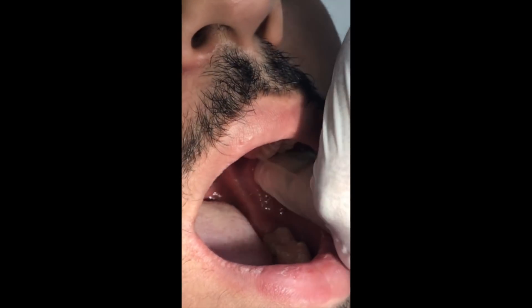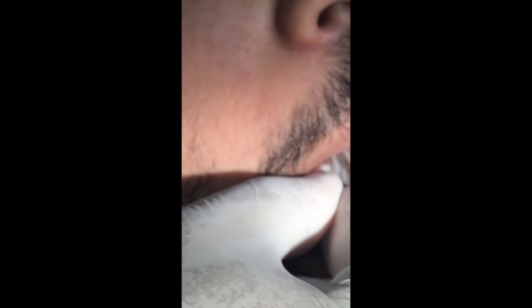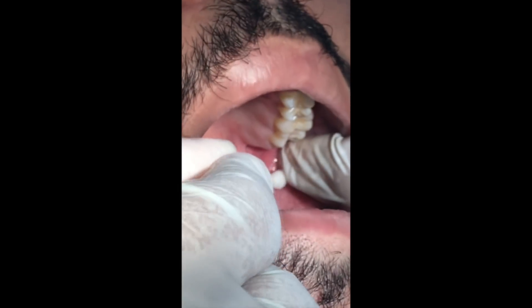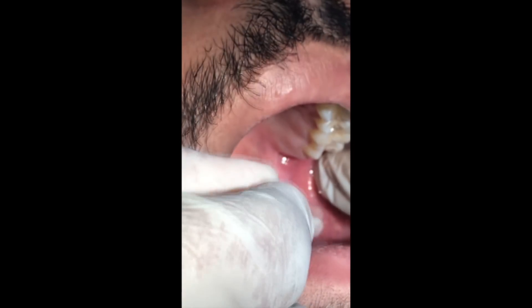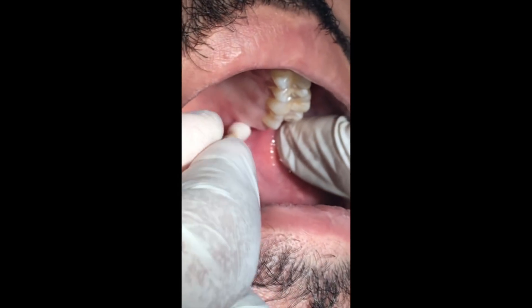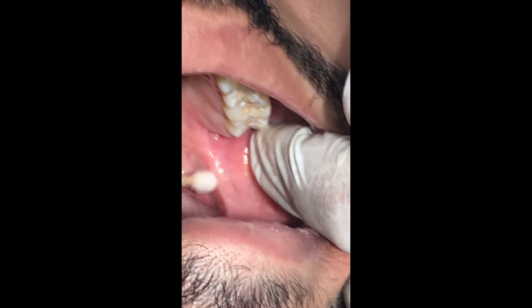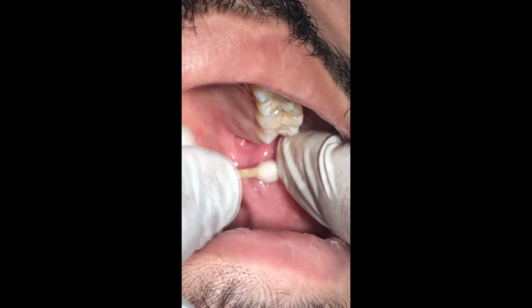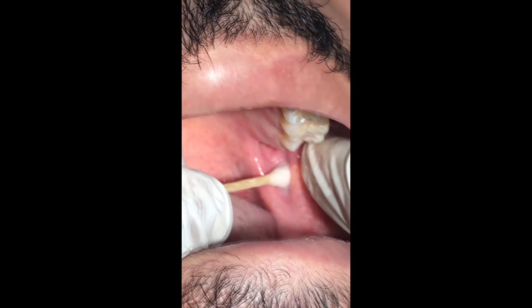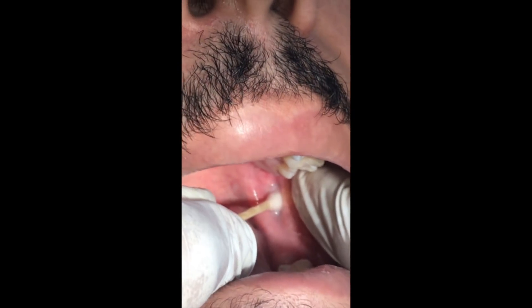Here is where I rotate my finger. The first point is the midpoint on my fingernail. The second point is where the raphe changes direction — tracing vertically after being horizontal. This is the line. Bisect it: one medial third and two lateral thirds. Here is the point of needle insertion.